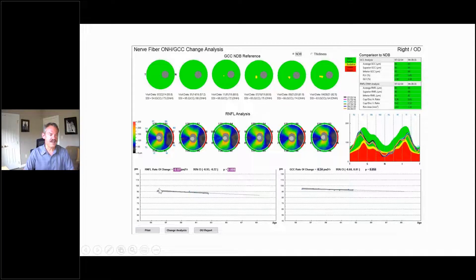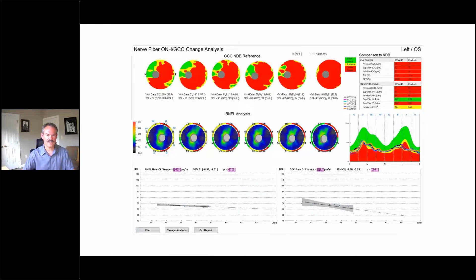The nerve fiber layer is being flagged, but that's fairly stable as well. So the right eye OCT looks pretty good.